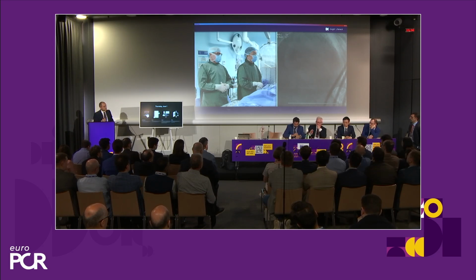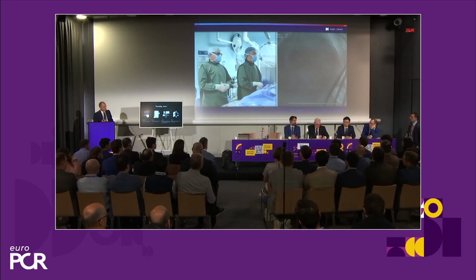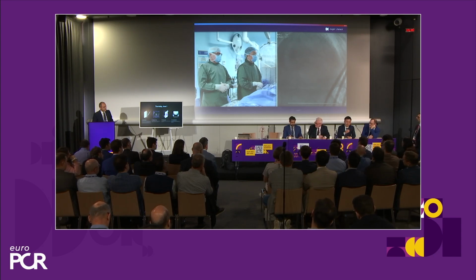Jacek, you did it physiology guided, we know, but do you think this can be simply done with angio guidance, and if not, why? I believe with angio guidance, we will always finish with stenting all along the vessel, so it's the worst scenario for me. The problem is if we need to choose between physiology and imaging, because they are both expensive and in some countries there are limitations to do so. So probably at this stage of knowledge and my experience, I would prefer IVUS guided procedure to get optimal stenting result. So if you really had to choose between one or the other? One or the other, but okay.